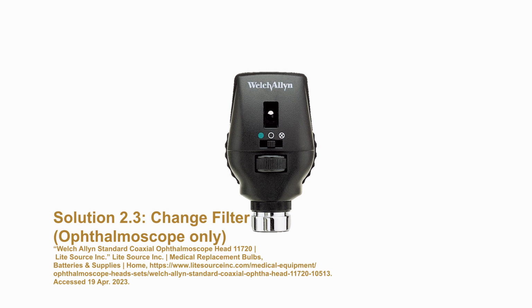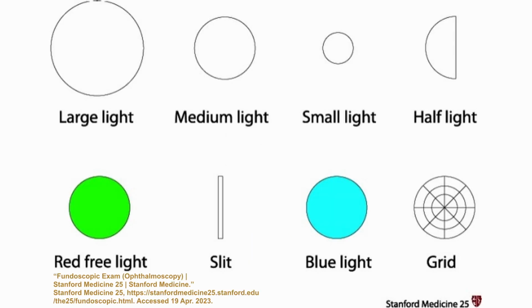Ophthalmoscopes have different filters for different uses. This is controlled by the filter switch on the front of the head above the aperture dial. The red free filter is used to look closely at vasculature. The blue filter is used to look for corneal abrasions or ulcers with fluorescein dye. The slit is used to look at contour abnormalities of the cornea, lens, or retina. The grid is used to approximate the relative distance between retinal lesions. Check that the filter setting corresponds to the intended use. For troubleshooting purposes, it may be best to remove all filters.